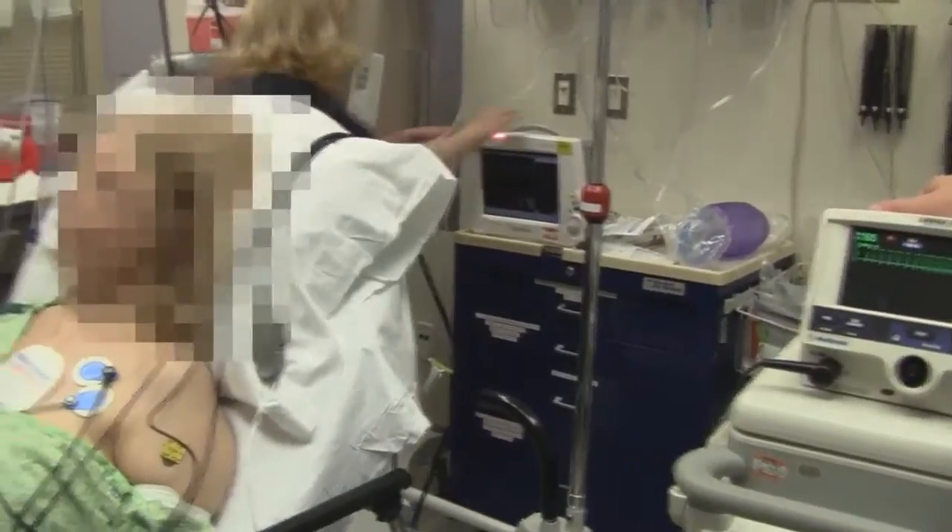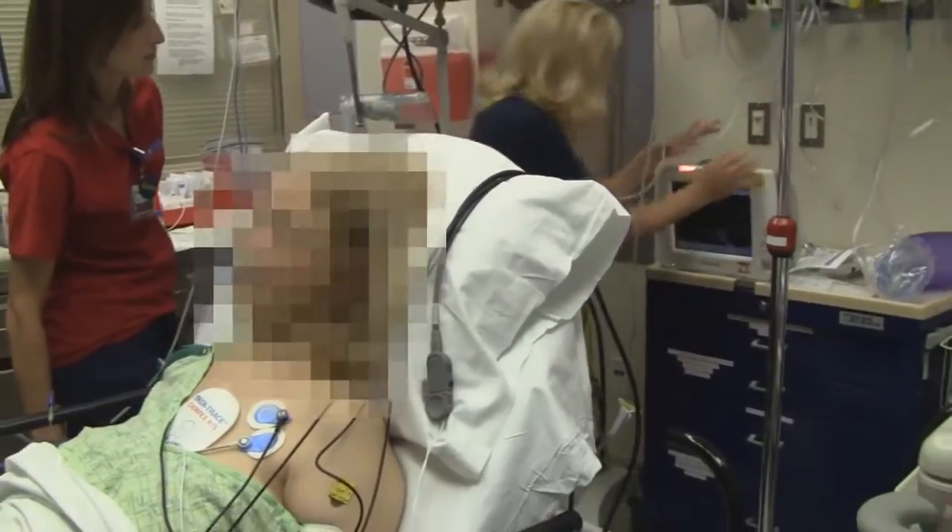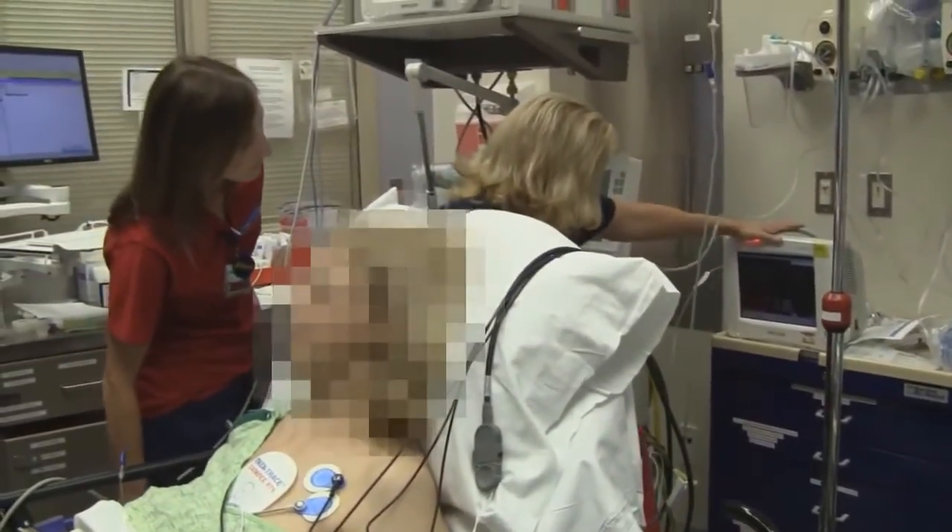Suction's ready. Airway equipment's all ready. End-tidal CO2 is on. Nursing staff, do you mind being on YouTube? No.